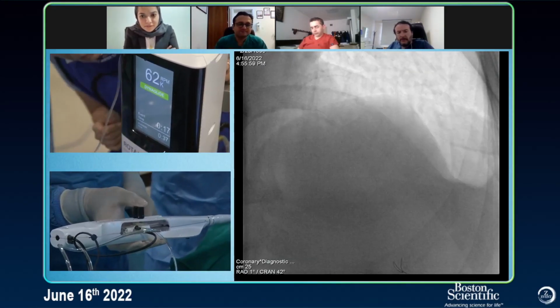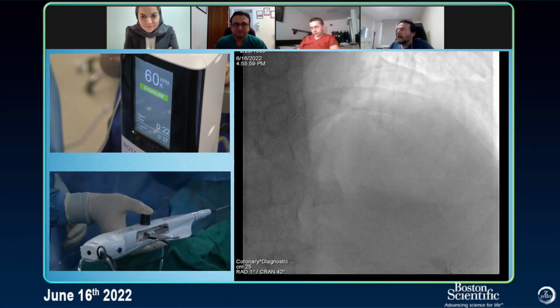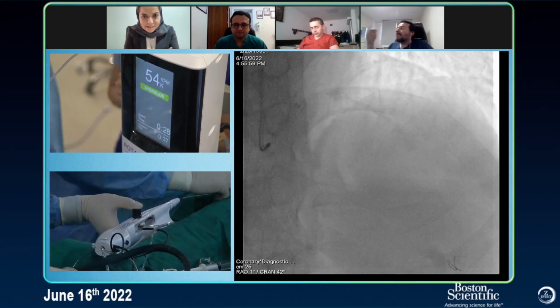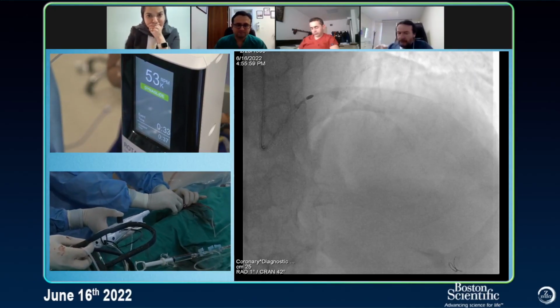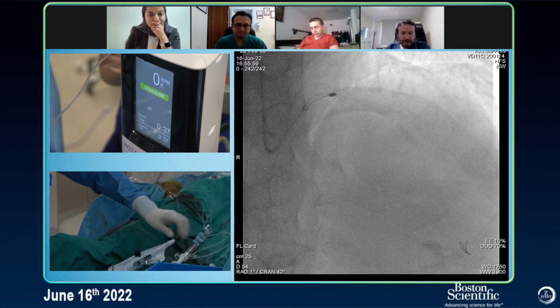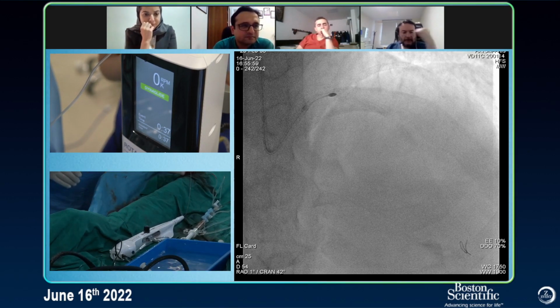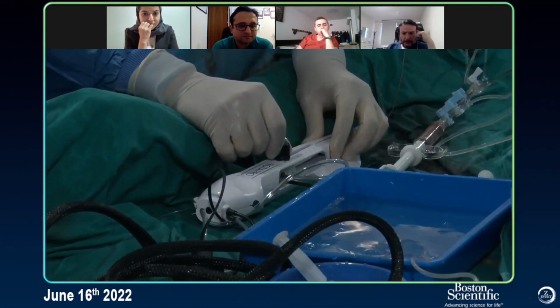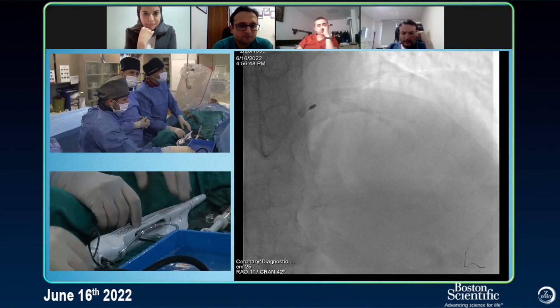Probably watch the tip of the wire. Let's go a little further toward the left main. Okay, a bit more. Go into the left main. Okay, stay. Stop. So now we are almost in the left main. I could go a little bit further, but let's start from here. So we are ready. Before starting, I'll come back to the end of the rail, like this. Do you see my hand? Okay, now we are ready.